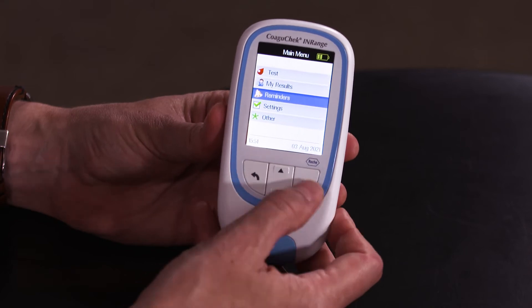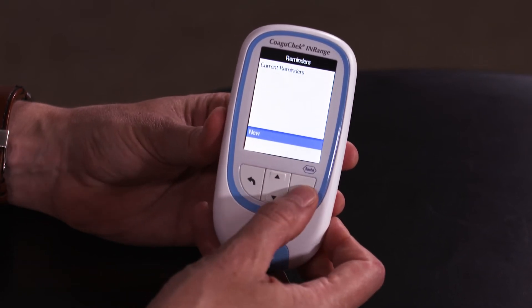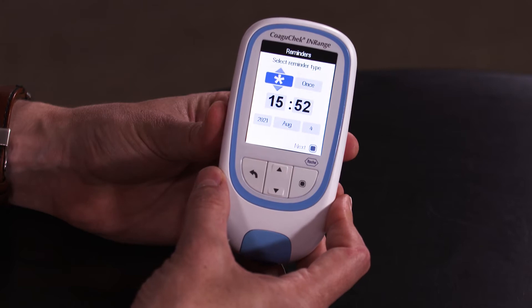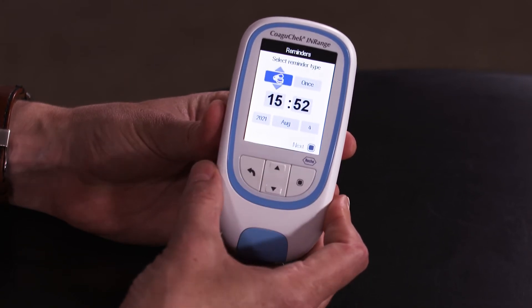You can set reminders on your meter. To do this navigate down to reminders in the menu and press the power button to confirm. Confirm new. You can set reminders for blood tests, others, appointments and medication.